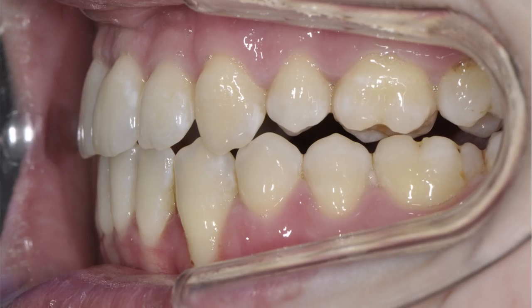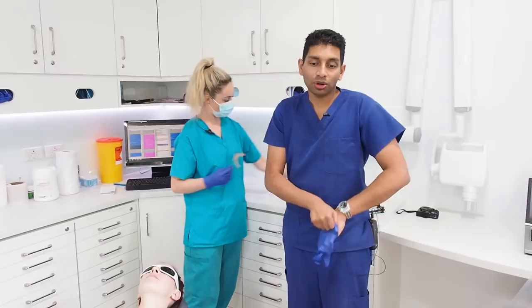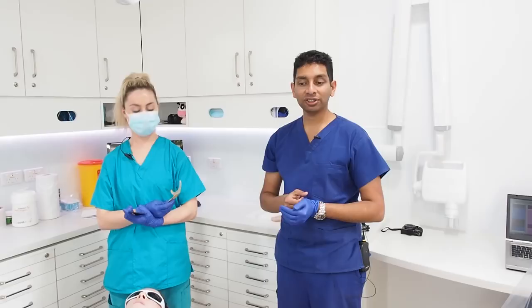Now we're going to use some mirrors to do the occlusal shots. There's always a debate about whether you have to reverse the mirror shots. My philosophy is it doesn't matter what you do, just make it consistent. If you never reverse it, don't ever reverse it. If you reverse it, make sure you reverse every single one. I never reverse it because it's easier that way.